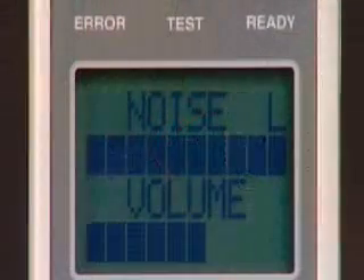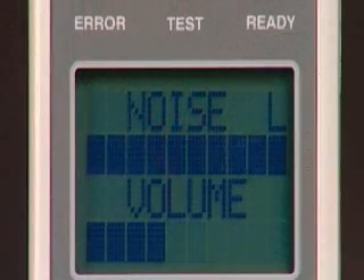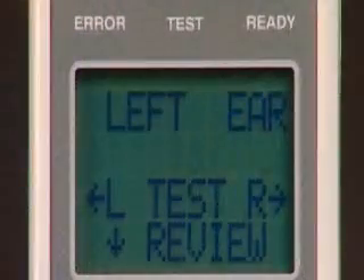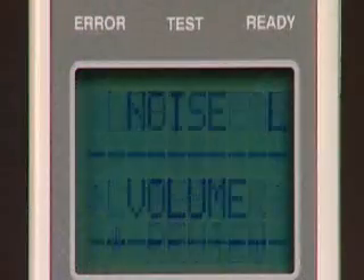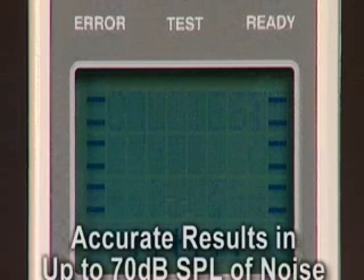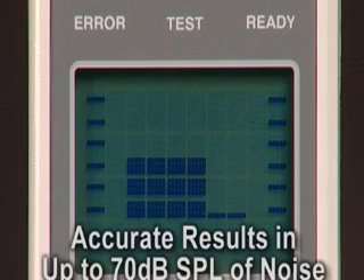If the noise bar will not move to the left, there is either too much noise in the testing environment, the subject being tested is too noisy, or a proper seal has not been obtained. Check for excessive noise and then start again. Note that while a quiet testing environment is desirable, the AeroScan's artifact rejection allows for accurate test results in up to 70 dB SPL of noise.